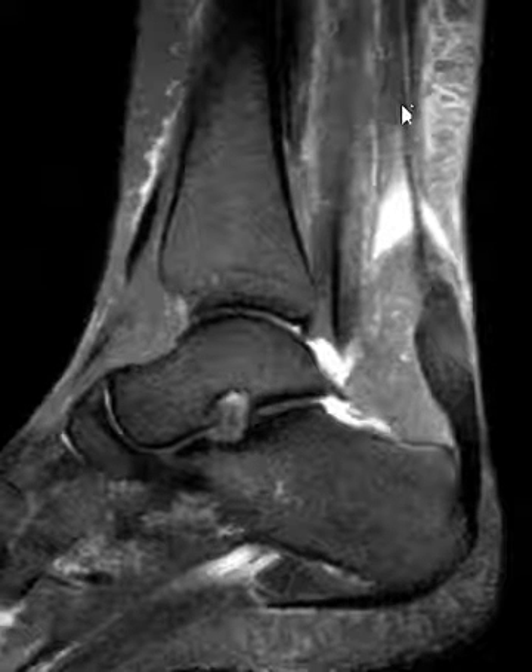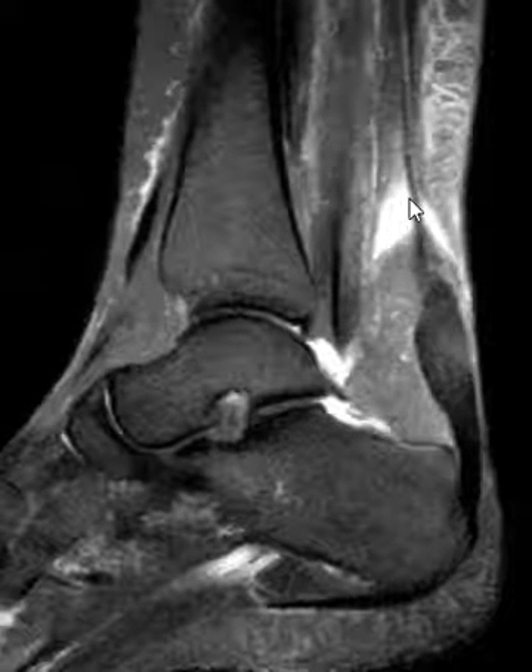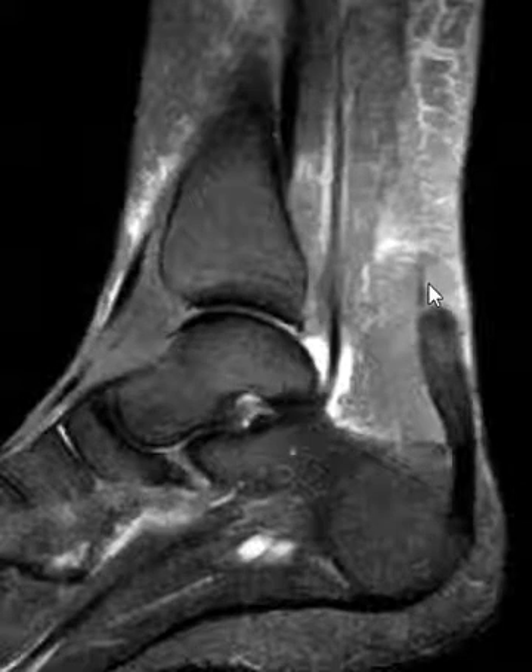Here we see the little band coming down here. In the past, I think I've personally made the mistake of thinking that maybe it was a little intact band of the Achilles tendon. But this is the plantaris tendon. It goes along the medial margin — something to recognize.